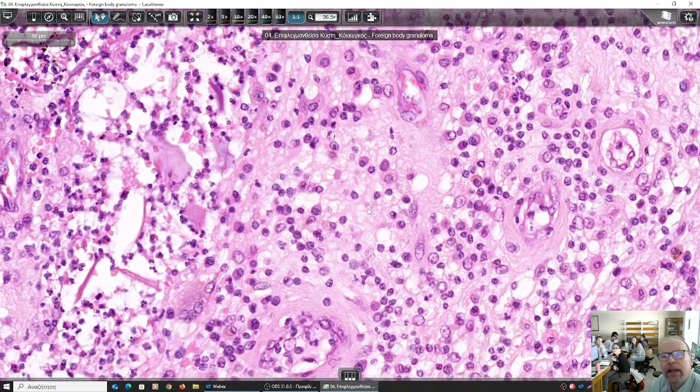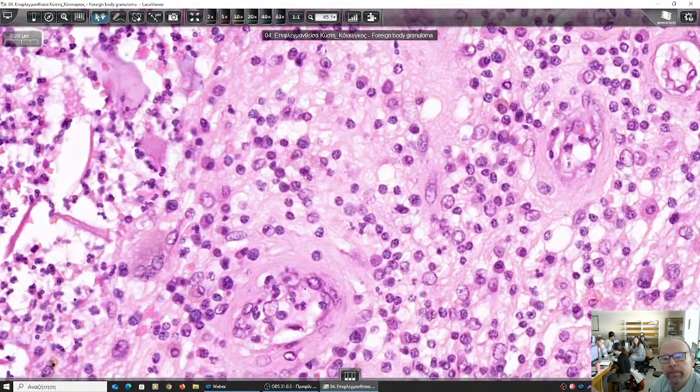We have the inflammatory cells. So tell me, what inflammatory cell is this? Neutrophil. Is it an inflammatory cell? Yes. You say yes, but since it is in the blood, in the lumen, it is a white blood cell. It has not yet become an inflammatory cell, because if you see the same cell in the inflammatory exudate, you'll say it's an inflammatory cell. The cell is the same, but if you see it in the lumen of the vessel, it's a white blood cell. No, it's the same cells.